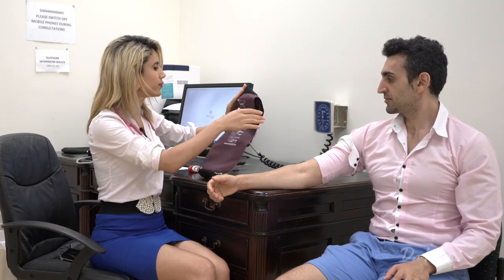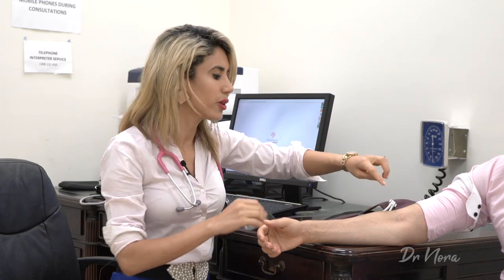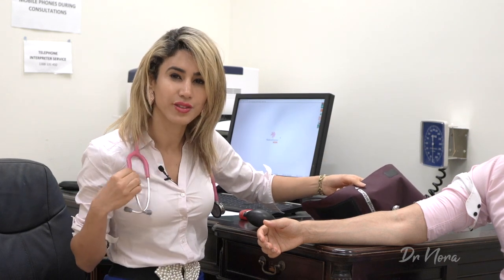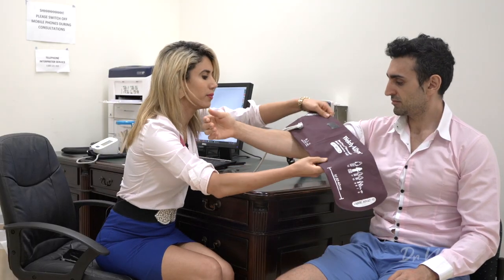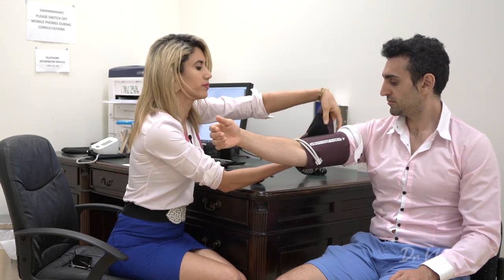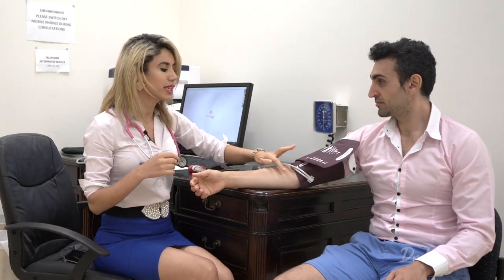Now to place the cuff over the upper arm. If you look at your cuff, you'll see there is a marker for where the artery should lie. When we look at the elbow, this is called the antecubital fossa, and medial to this is the brachial artery. This is the artery that corresponds to where you should be aligning the cuff marker, and it's this artery that we listen to with our stethoscopes to hear the Korotkoff sounds that we're going to hear very shortly. Wrap the cuff so it's nice and comfortable and ask the patient to relax their arm, leaving space to place your stethoscope in the antecubital fossa.